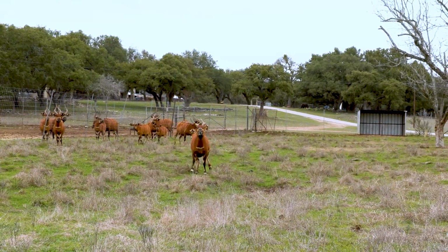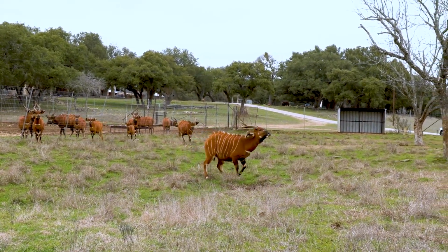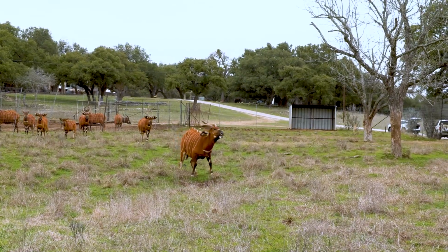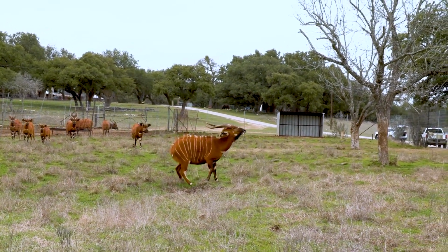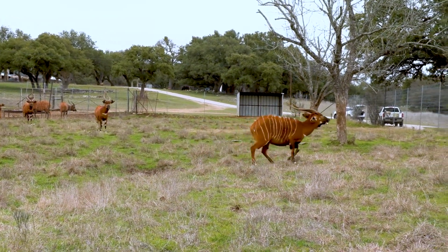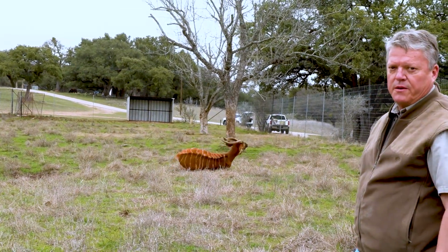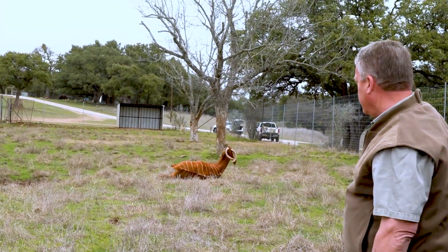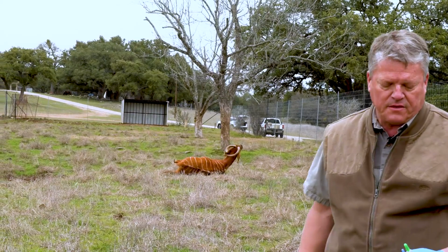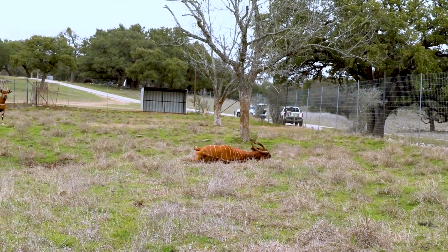This is one of the parts where you need to know the normal behavior. They will approach you, where they'll walk right up to you. Once she goes down, because we didn't put it in the most appropriate location, it was a delayed induction, but now she's down. So the important part now, again, is to approach her and be safe about it.